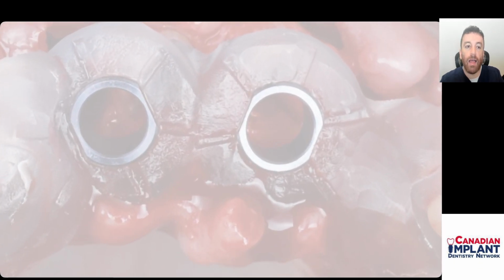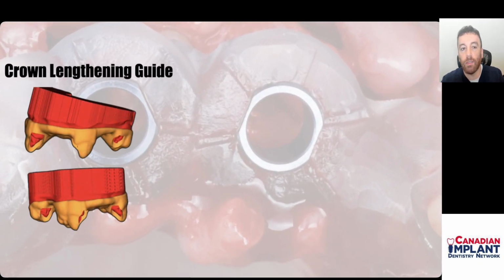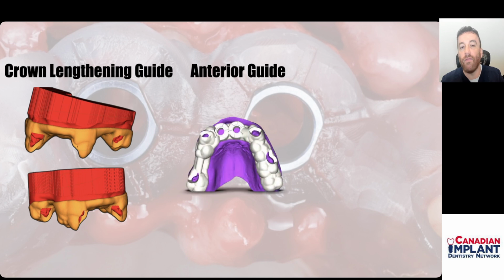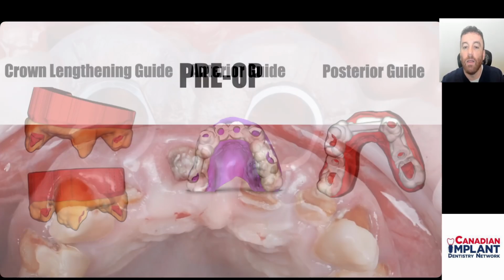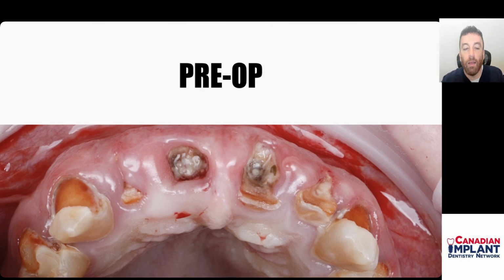Next, we have our laboratory perform two things: crown lengthening guide and then a set of guides for anterior implant placement and posterior implant placement. Before we jump to pull out all the teeth though, we take advantage of the fact that he has teeth. Teeth supported guides are the most stable, meaning that we have those guides sitting on teeth that are going to be potentially removed, but using them as supports for those guides. Once those teeth are removed, then we can go ahead and place implants in those positions if necessary.